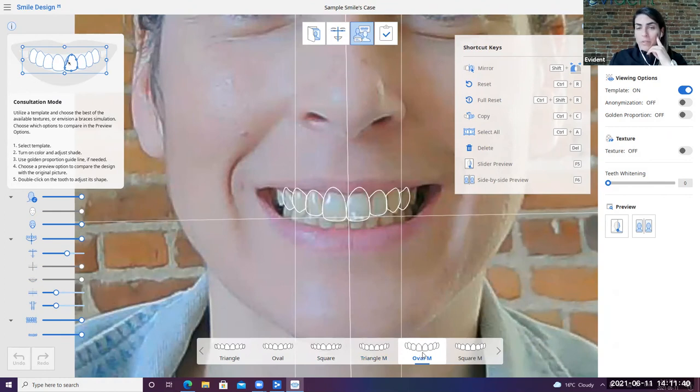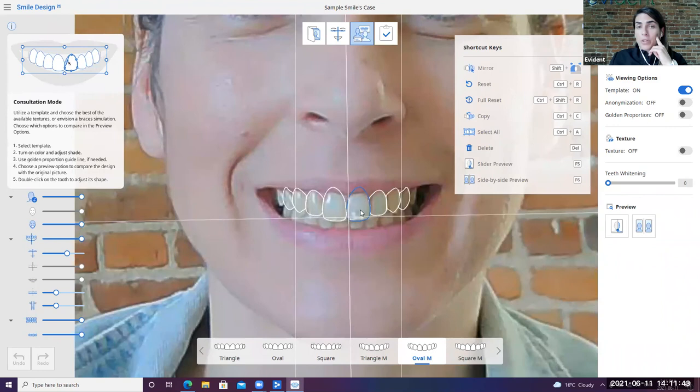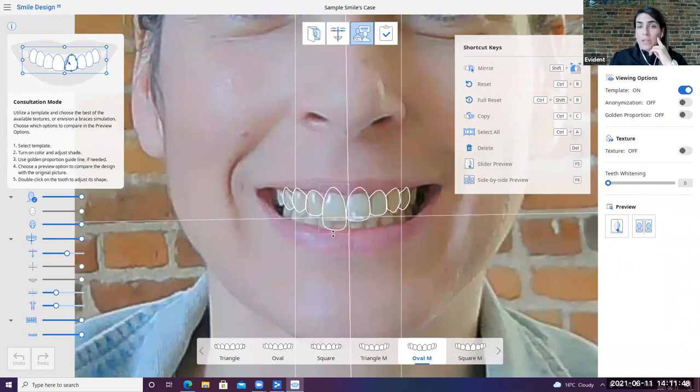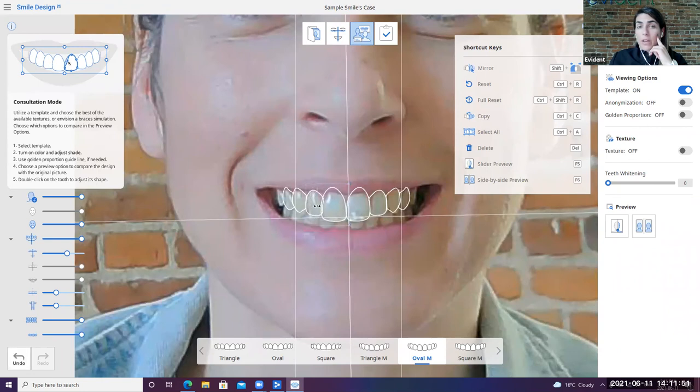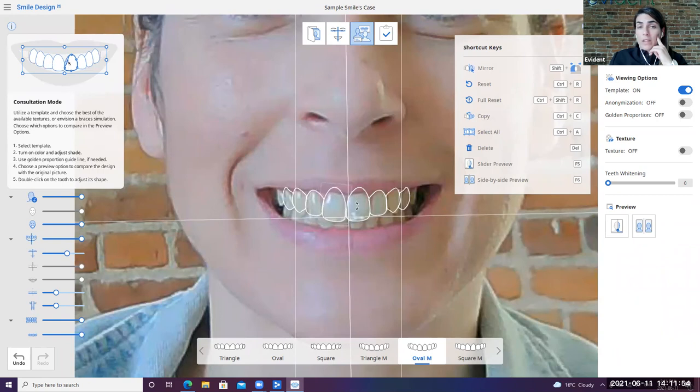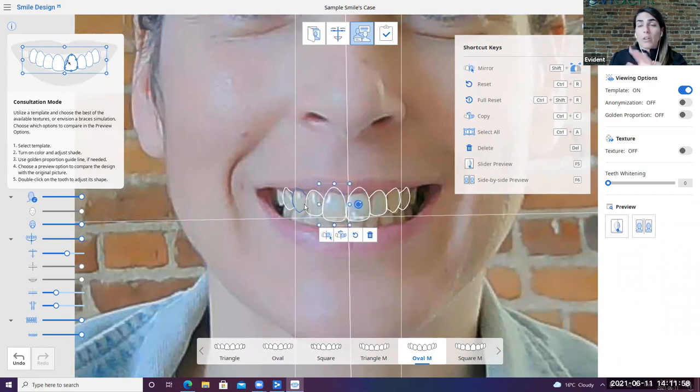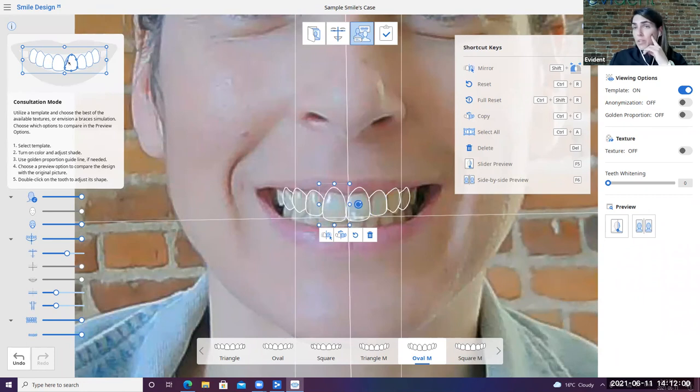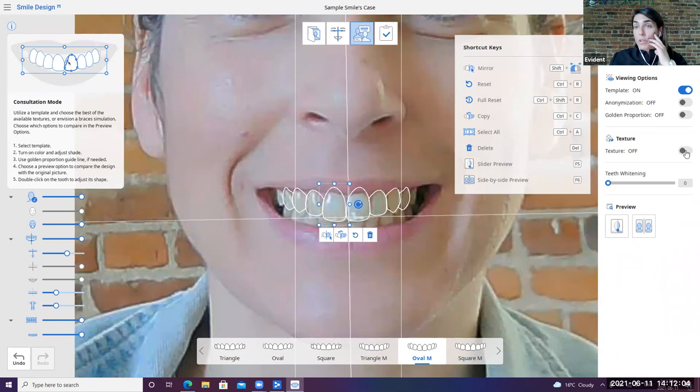So from here, we can start making some adjustments to the case. So if you click on each individual one, you have the opportunity of lengthening it or making it mature. You can make it wider, all of that kind of stuff. You also can rotate it depending on what you're needing to do. Once you've taken care of your structure here, then you have a variety of different tools here that you're able to utilize in order to make it work for you.